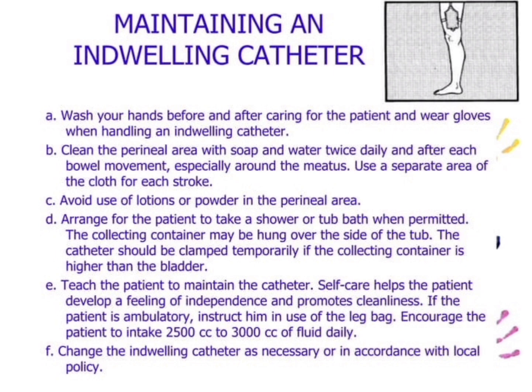If the patient is ambulatory, instruct him in use of the leg bag. Encourage the patient to intake 2500 cc to 3000 cc of fluid daily. Change the indwelling catheter as necessary or in accordance with the local policy.